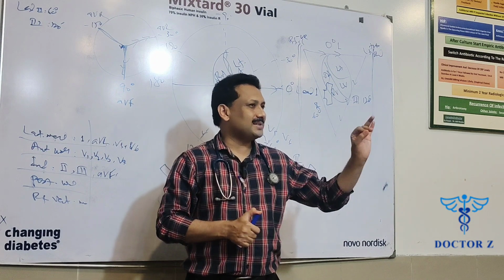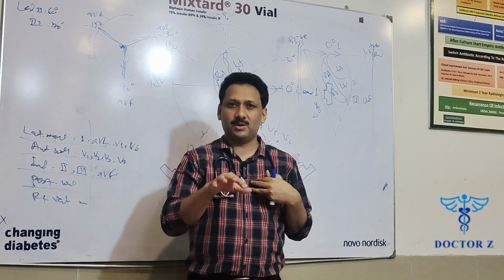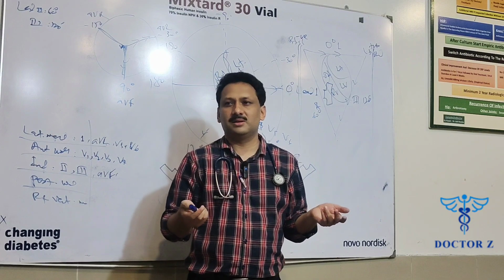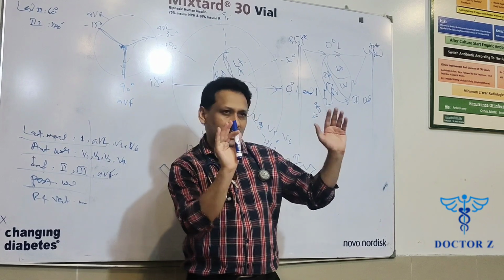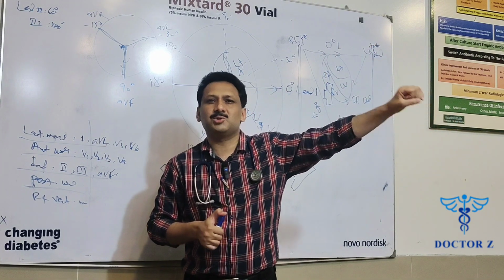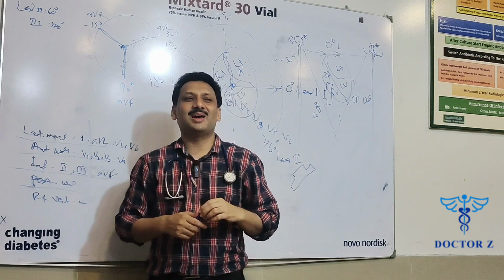So should I ask the person, that gentleman, now your frontal ECG has been done, please lie prone? I'll be placing these electrodes on your back and then I'll be seeing your posterior wall, as simple as that. So should I do that, or should I do something else? So the common sense, and the clear-cut picture up till now, is yes, I should do it. But have you seen people's ECG being done in that way in casualties as well as in wards? First we ask him to lie supine and then we twist him and ask him to lie prone.